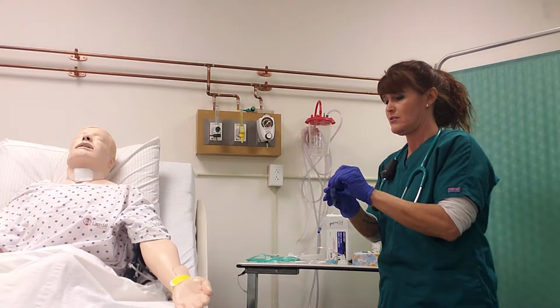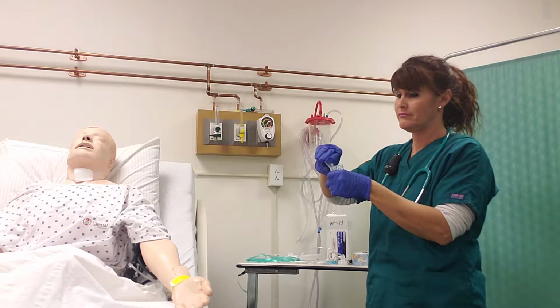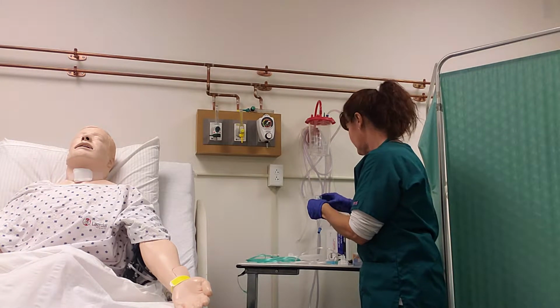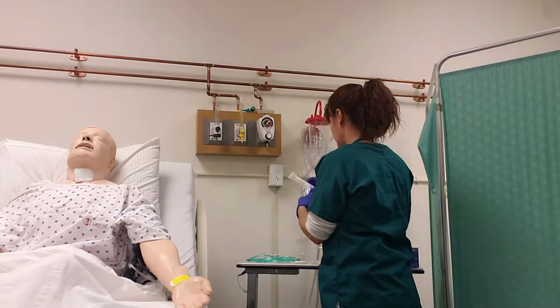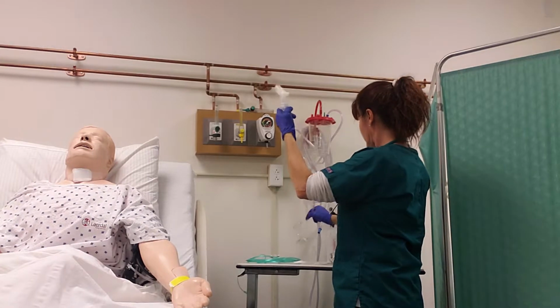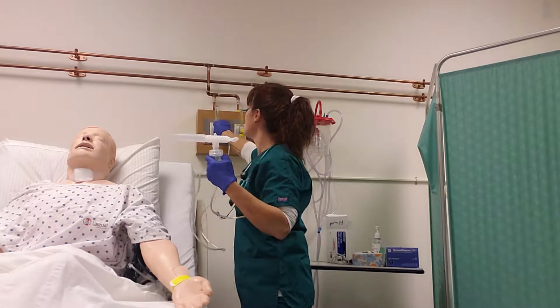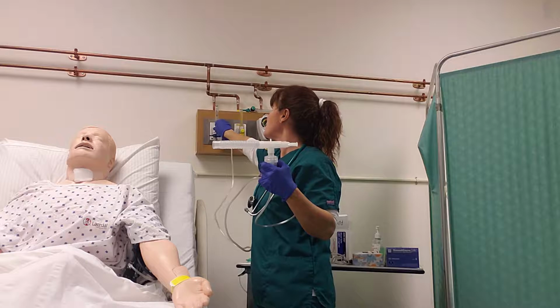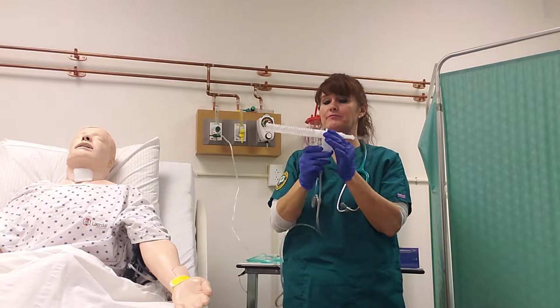So today we're using albuterol. We're going to use a whole vial. All right, so we're going to set this to about a 10 liter a minute flow. We have to make sure that we have adequate mist coming out.